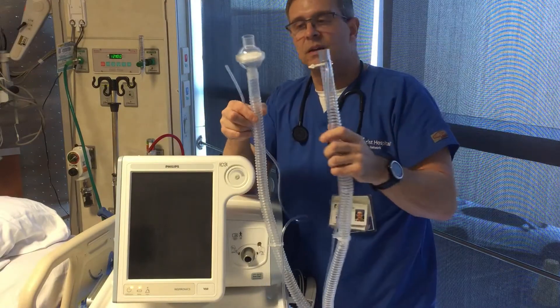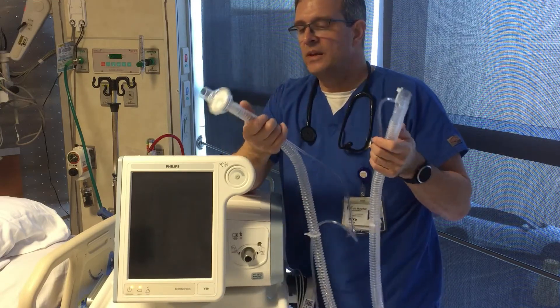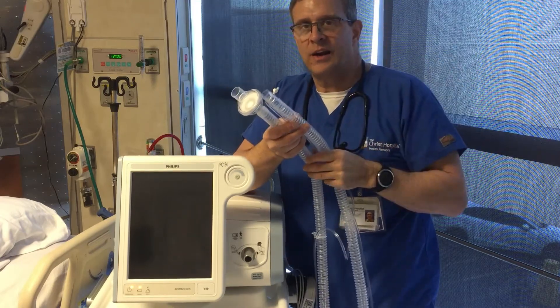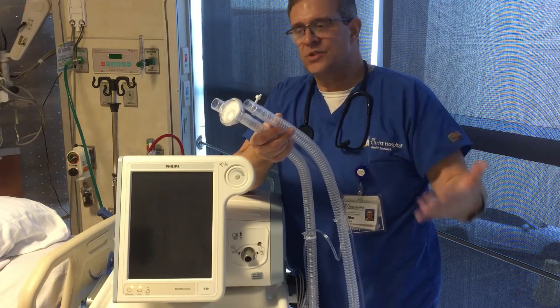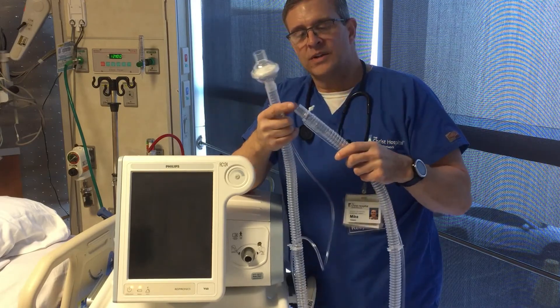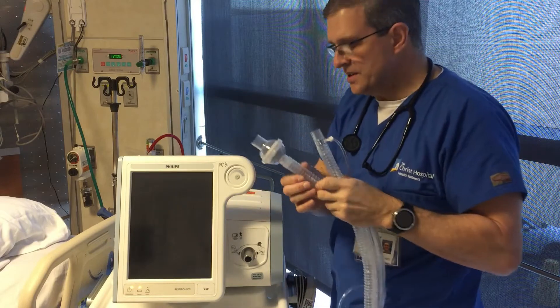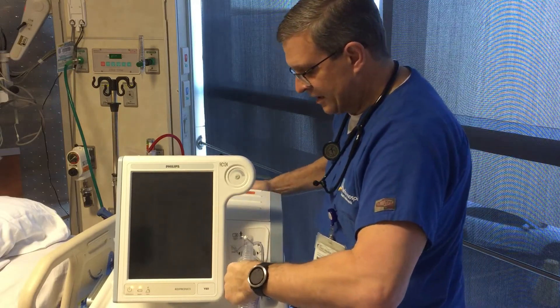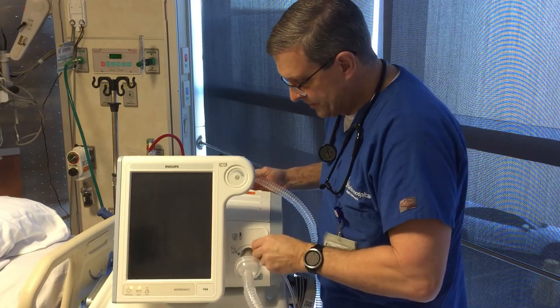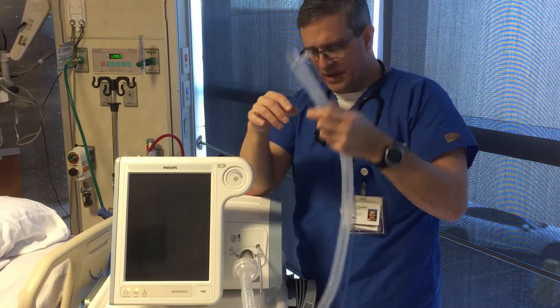This is the circuit that goes with it. The important thing about non-invasive ventilation circuits is that they need to be smooth bore on the inside. If you use corrugated tubing, which is jagged on the inside, it creates turbulent airflow and causes a lot of resistance, which will create pressure in the circuit and cause it to cycle off sooner. You want the flow to be smooth. We put a filter on here to hook to the inspiratory side, then put it on our patient outlet port — that's where the gas comes out. Then we connect this pressure monitoring tubing, which connects up here so it can measure at the airway.